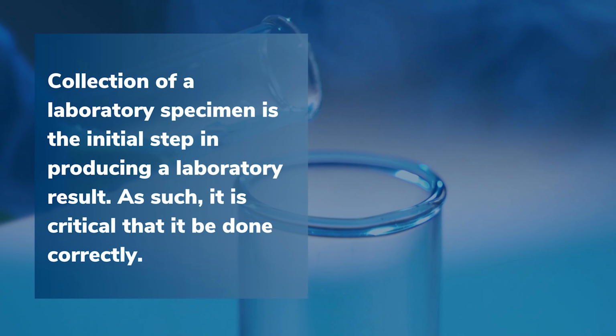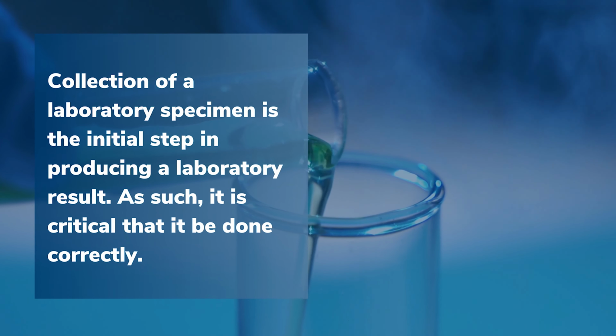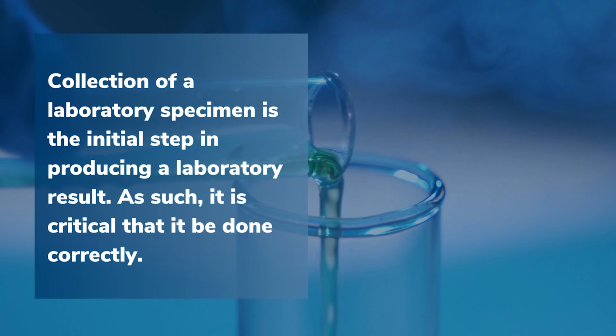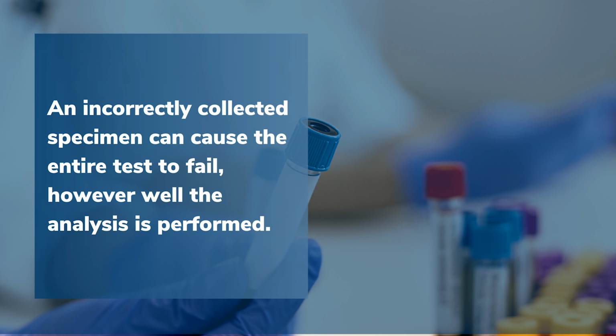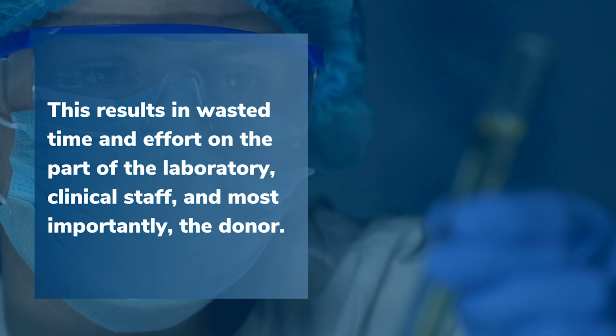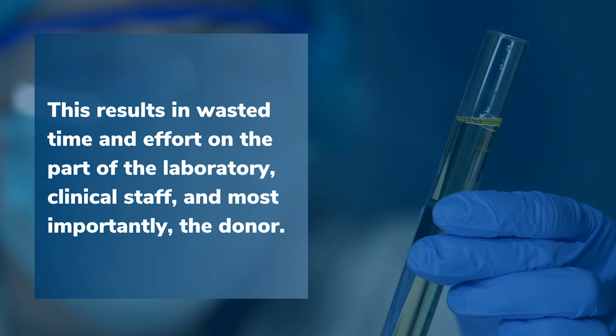The collection of a laboratory specimen is the first step in producing a laboratory result. As such, it is critical that it be done correctly. An incorrectly collected specimen can cause the entire test to fail, however well the analysis is performed. This results in wasted time and efforts on the part of the laboratory, clinical staff, and most importantly, the donor.